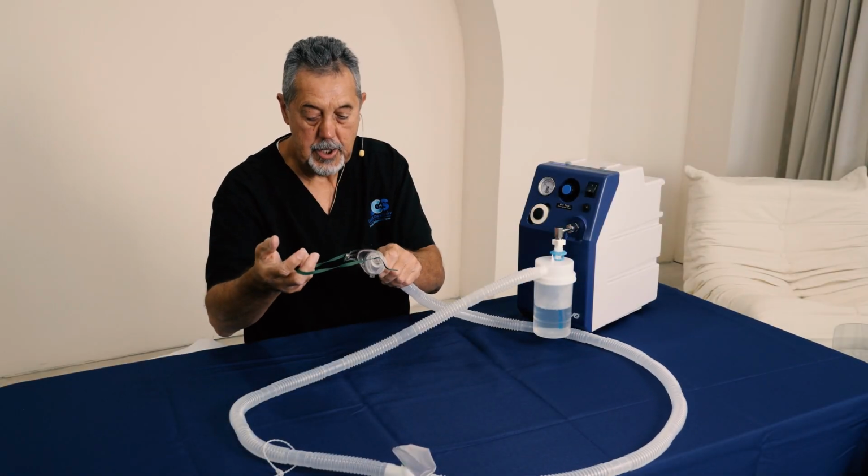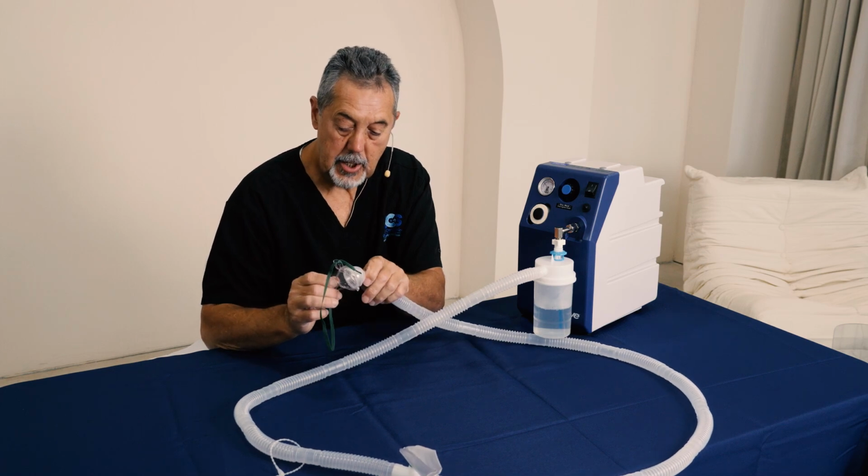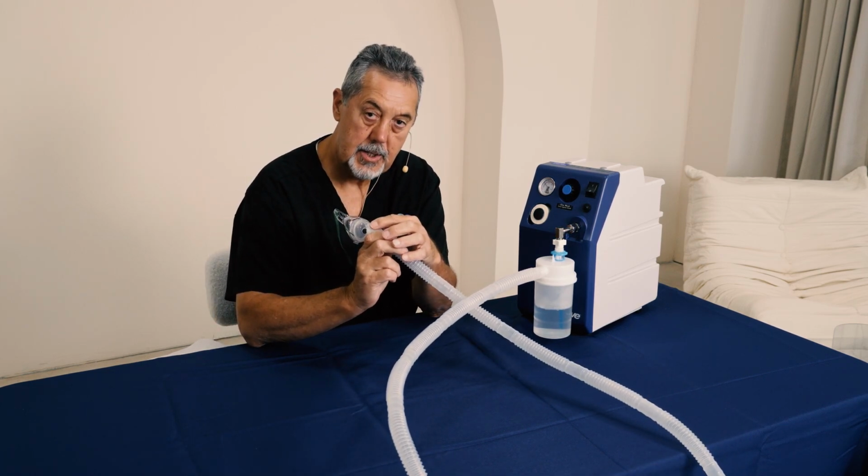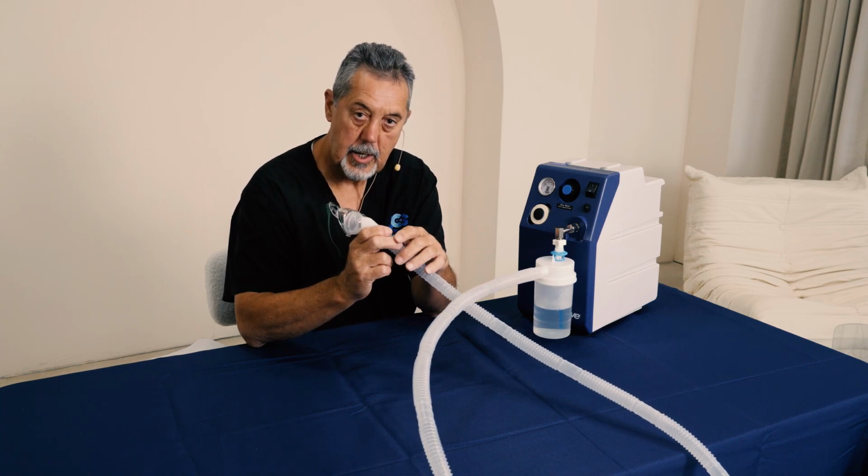When you put it on the patient, you want to observe and make sure that upon inspiration, you see a little bit of mist coming out through this hole right here.